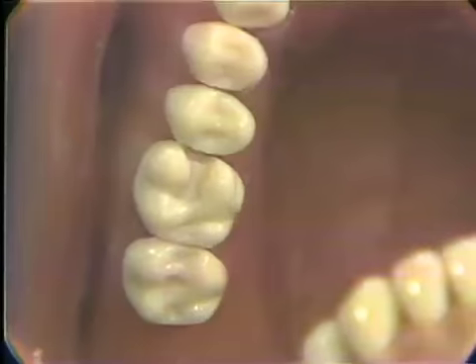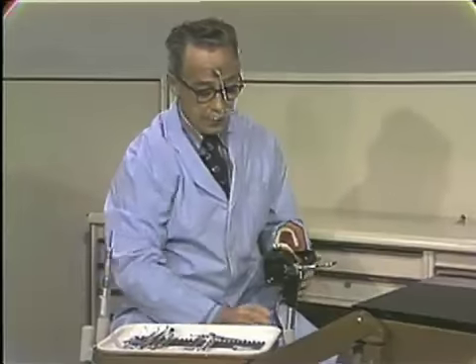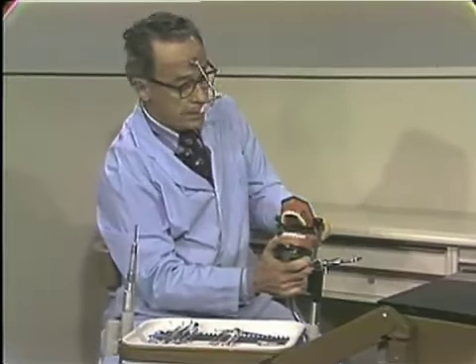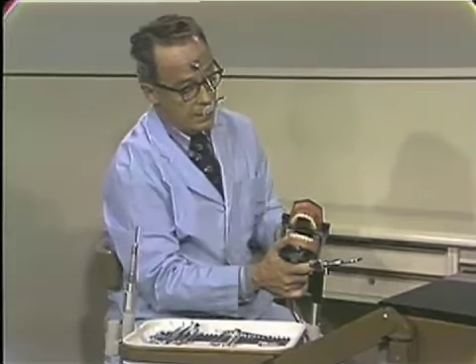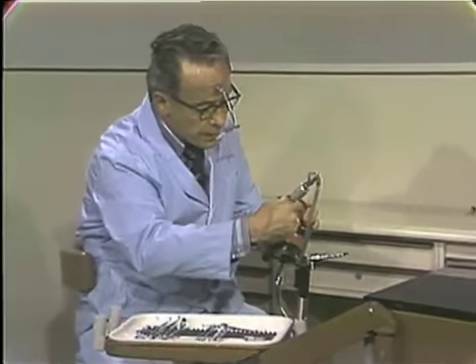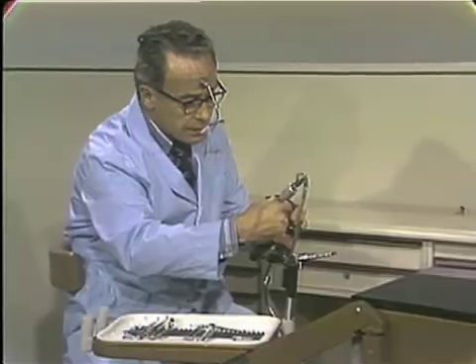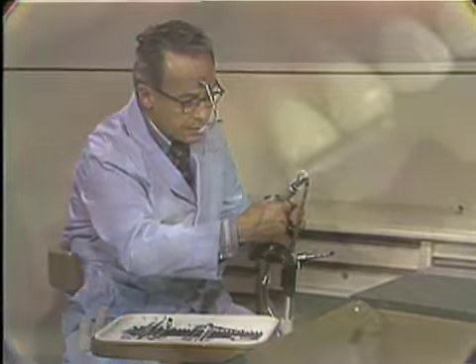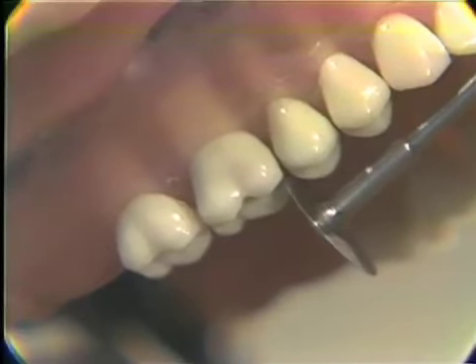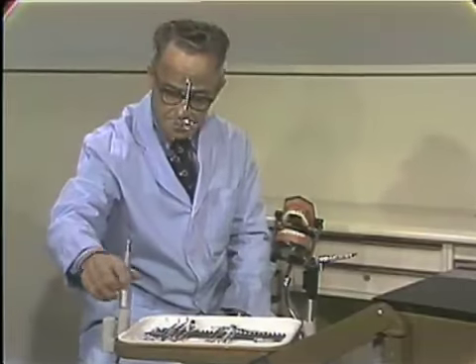After checking this, we will now position the patient so that we can slice. This means raising the patient up and turning the patient to the left. And again, we will test our disc. If you notice now, we can put our disc in from the buccal, and there's freedom of motion. It doesn't have much, but it's free. It will not catch. We will go back and check the lingual again, and there again we have the freedom. Now this means that we can place our slice, we can place the disc in there and run it without having the disc catch.